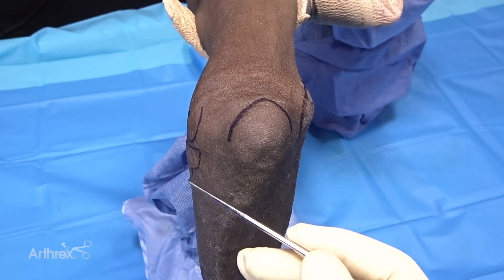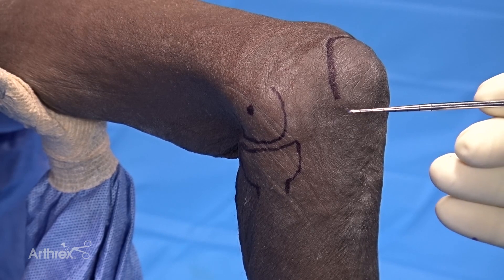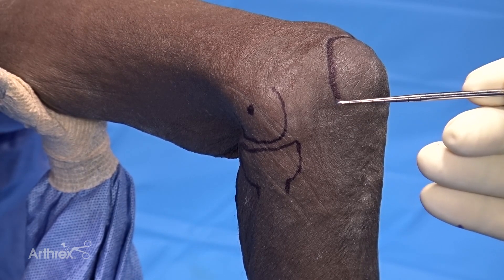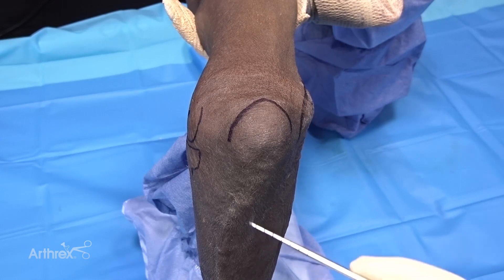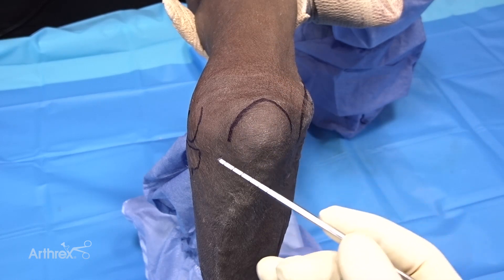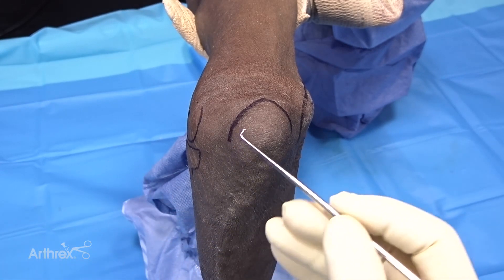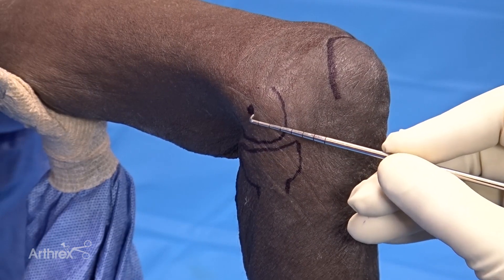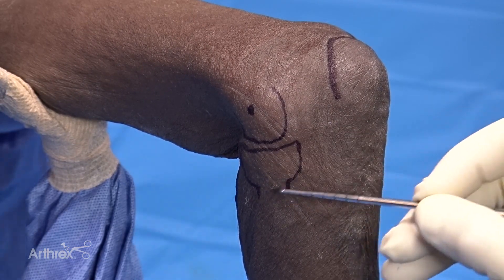This is a left upper extremity. We position it to recreate the lateral decubitus positioning of a patient. The hand is towards the bottom of the screen, the shoulder is towards the top, and the patient's head would be to screen left. For orientation we have the olecranon, the lateral epicondyle, the capitellum, and radial head.